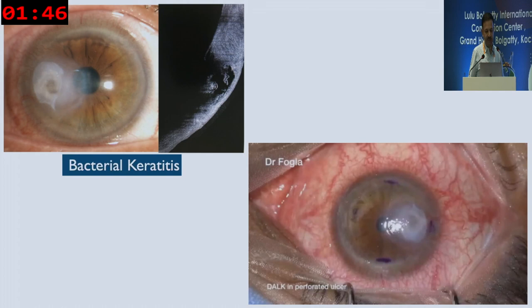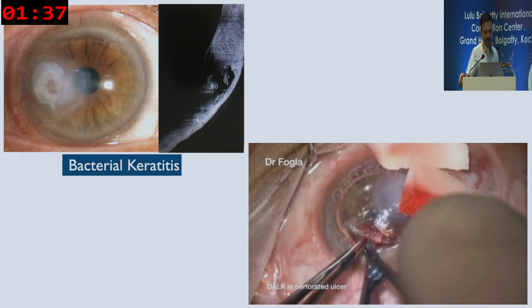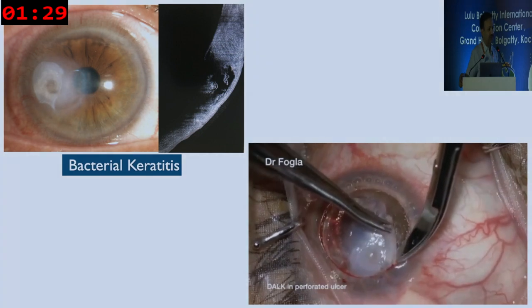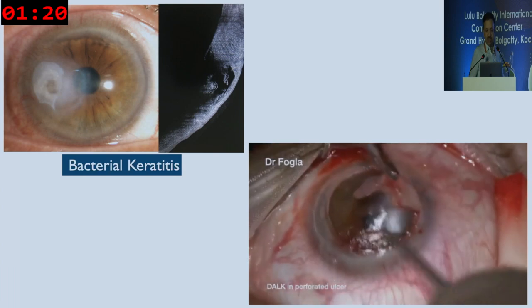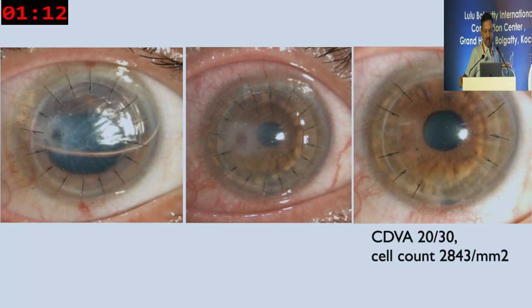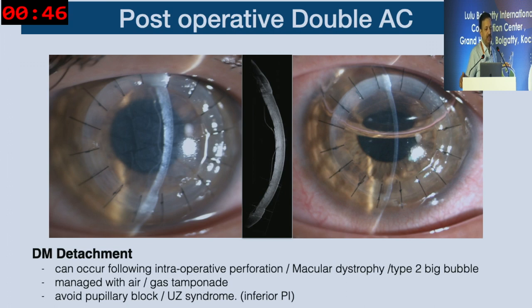In a complex scenario with a perforated ulcer where glue and amniotic membrane had been applied, we decided to do a manual DALK starting from the opposite end, performing manual dissection after reaching 85–90% depth, with a little sharp dissection near the perforation. At one month the cornea looks clear with good cell count of about 2800, and corrected vision of 20/30. For any perforation, surgically create a small inferior PI then do a complete air fill, or perform rebubbling post-operatively — remember to keep the pupil dilated to prevent pupillary block.